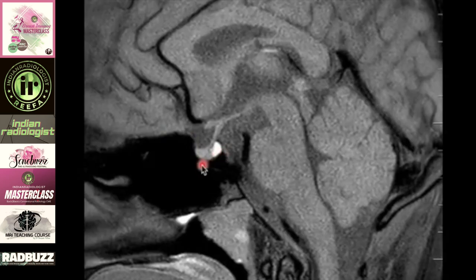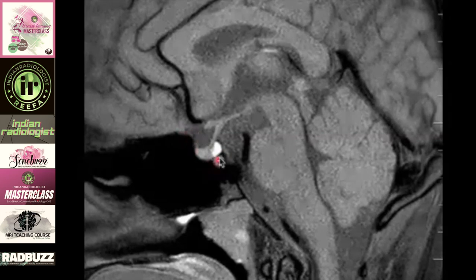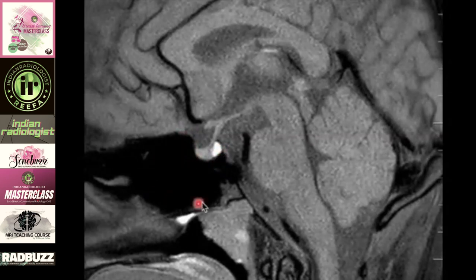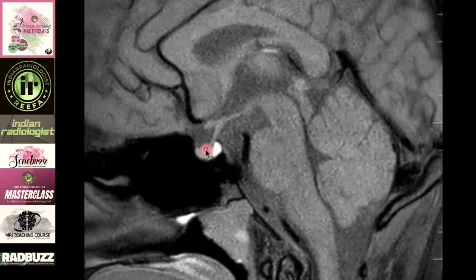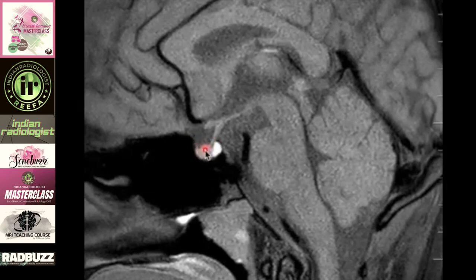The pituitary gland lies in the sella, which is a bony concave cavity. Anteriorly we see the tuberculum sellae, posteriorly the dorsum sellae. The sella is very closely related to the sphenoid sinus, so any abnormality in the sphenoid sinus — for example sinusitis or a mucocele — should be reported when reporting sellar pathologies.